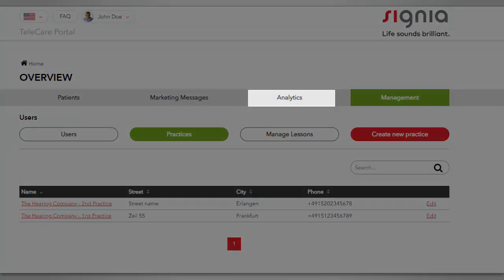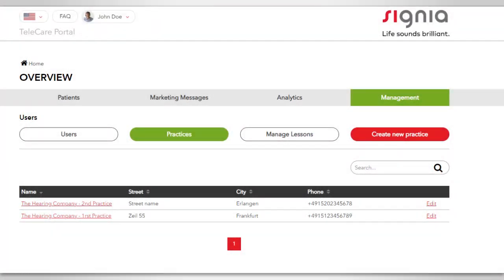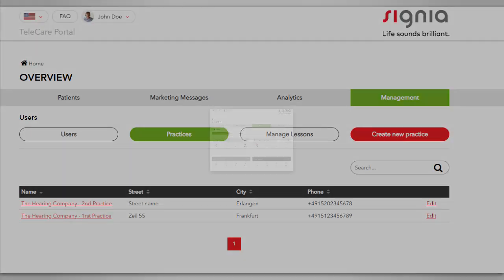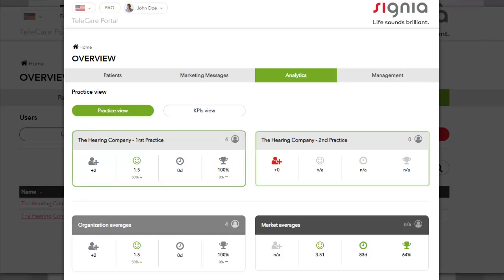The tab Analytics on the main menu enables you, the administrator, to monitor key performance indicators such as satisfaction of the clients and trial success rate for all practices. The practice managers can monitor the key performance indicators of their practice only.